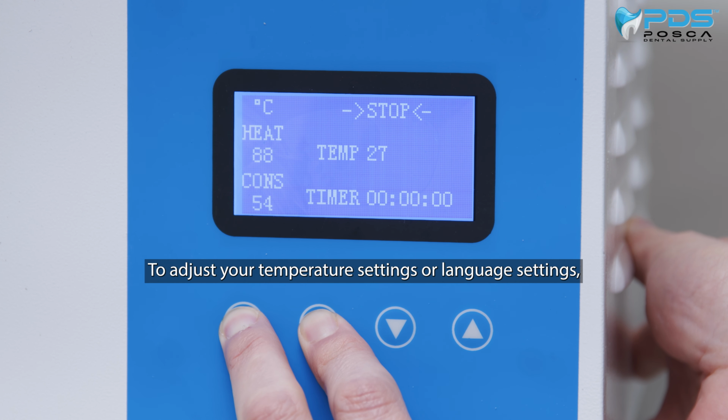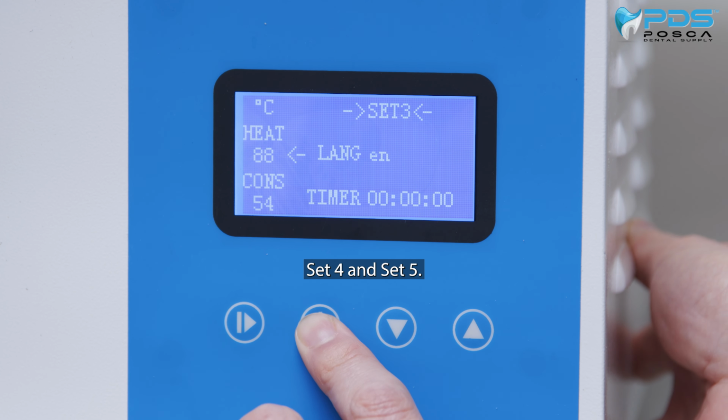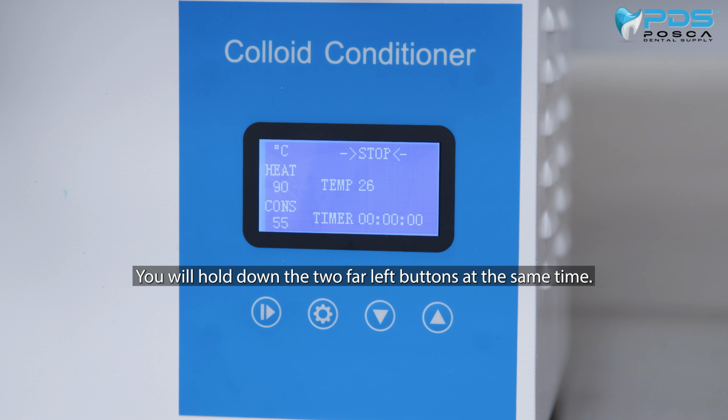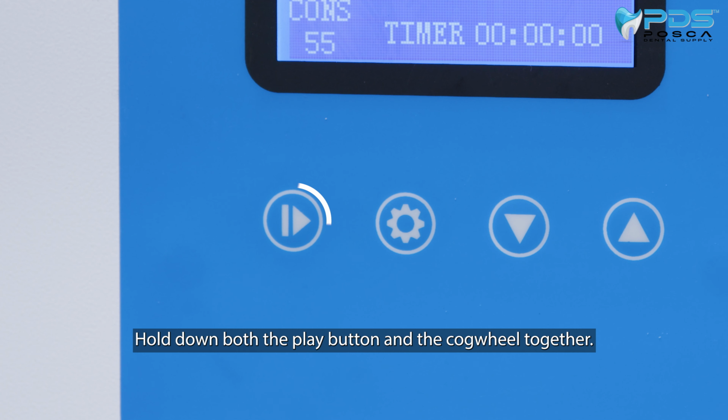To adjust your temperature settings or language settings, you enter into Set 3, Set 4, and Set 5. Begin by stopping your machine. With the machine in stop mode, you will hold down the two far left buttons at the same time. Hold down both the play button and the cogwheel together.